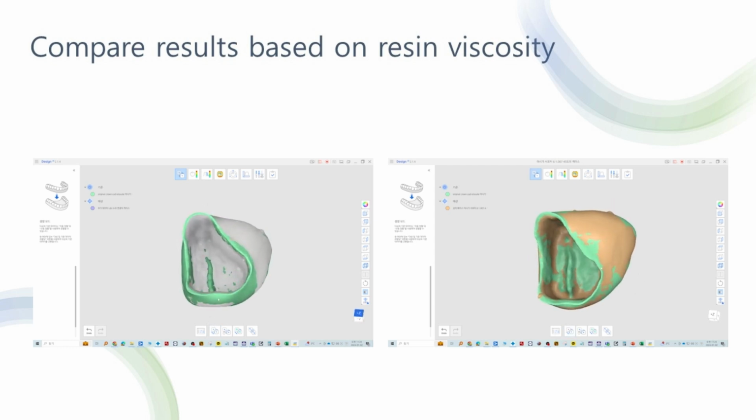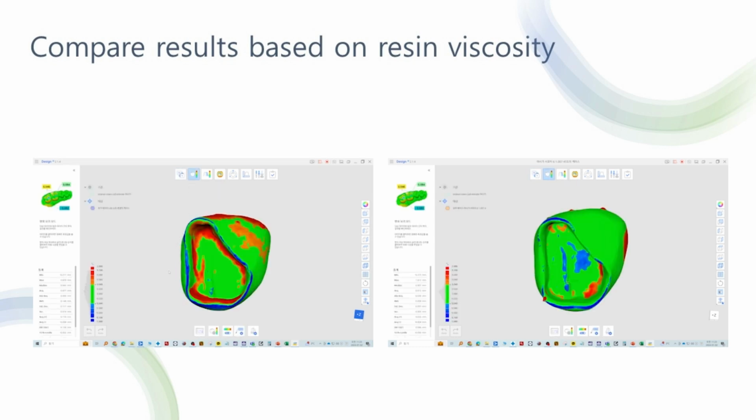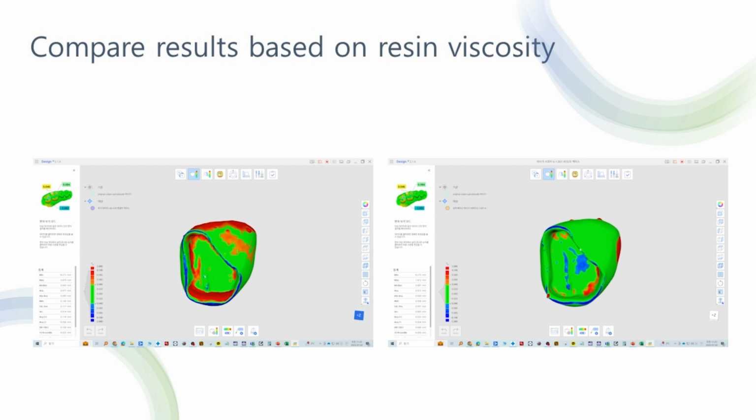It's important to note that higher filler content in the resin can increase its strength, but it also raises the viscosity and may reduce the reproducibility of the print. While using low viscosity resin is advantageous in reducing over-extrusion, achieving a balance between low viscosity and sufficient strength presents a challenging task. Therefore, selecting the right resin to balance strength, viscosity, and accuracy is crucial in 3D printing.